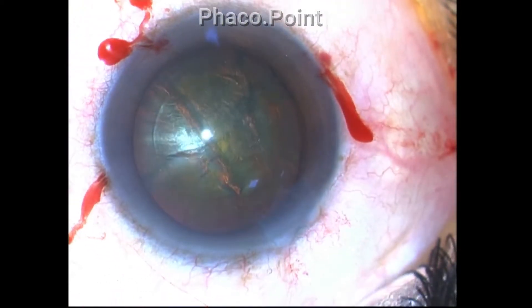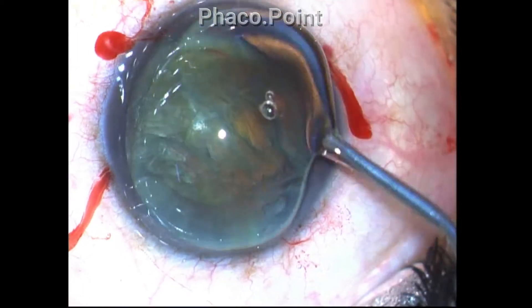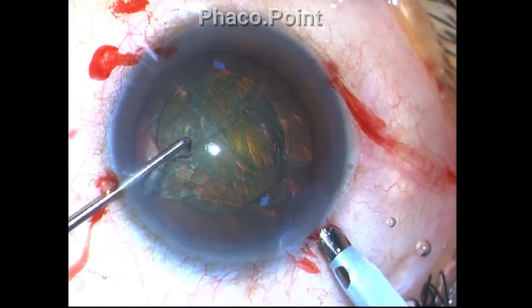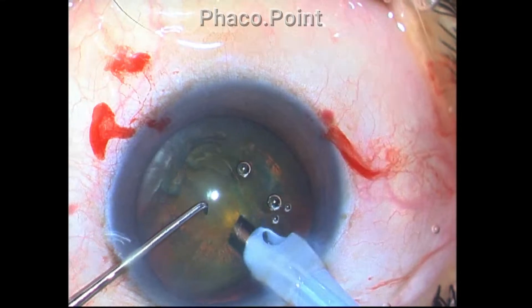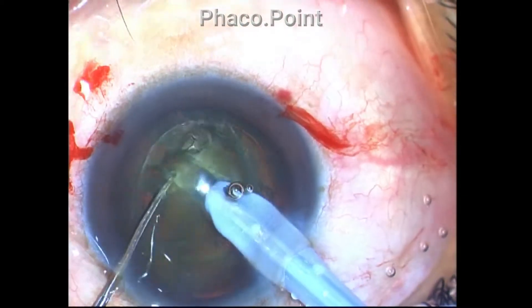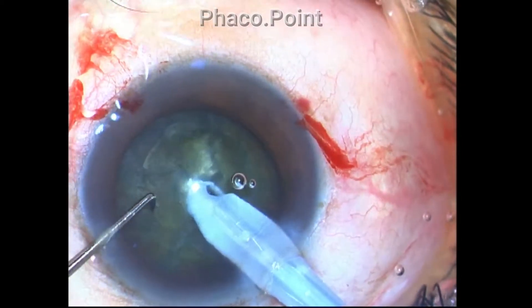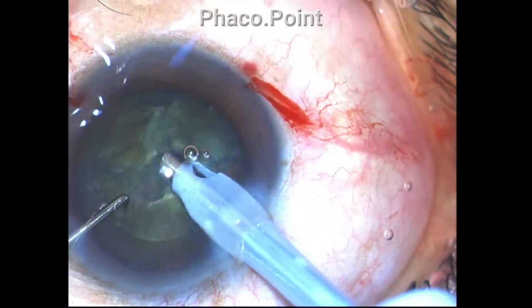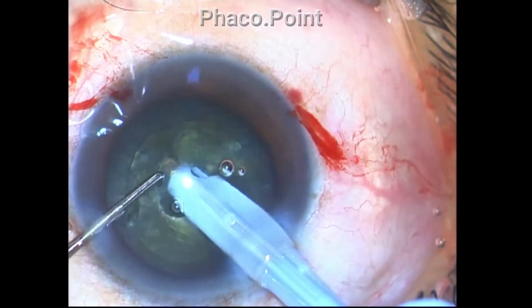Ensure good hydrodissection. Then start to create the fragments — while creating them, you can use trenching or chopping; it doesn't really make a difference according to the scientific evidence. My standard technique is the direct chop technique. After burying the phaco tip into the heart of the nucleus, initiate and create a crack — make sure the crack goes through and through, separate the posterior plate, and then create a small fragment. While making the chop, make sure that you create multiple small fragments and do not go for just creating four fragments.